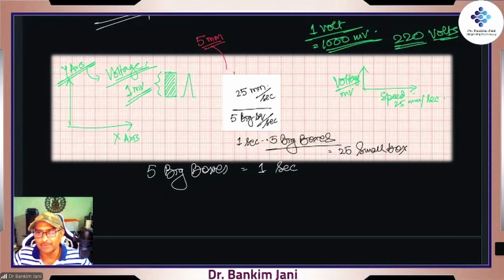No, I'm not clear what exactly you are asking. Are you asking about pins on the chest or other parts of the body to check the ECG? No, nothing is given. You are just given the plain paper. Everything is written onto this ECG paper, right?